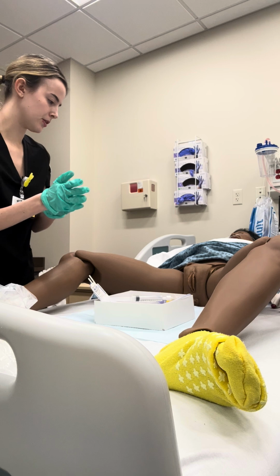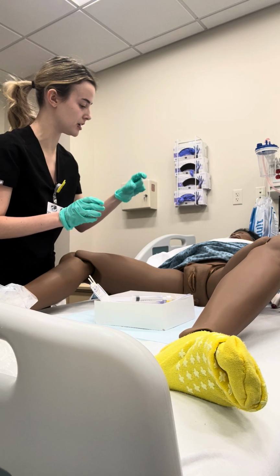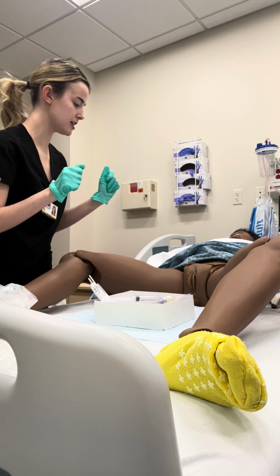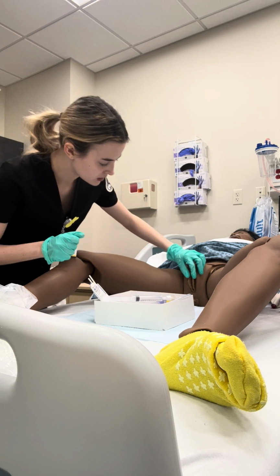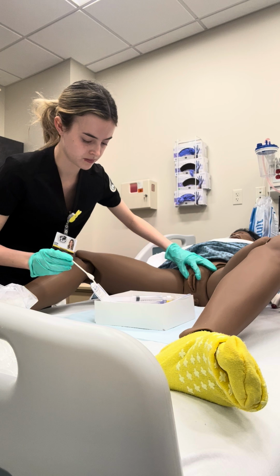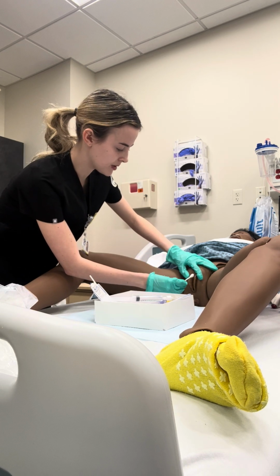All right, so now I'm going to go ahead and clean the area. So I'm going to be taking my hand and I'm going to use it to spread your labia, and I'm going to be cleaning with swabs, all right? And my hand will stay there throughout the procedure. So I'm going to start farthest away from me.